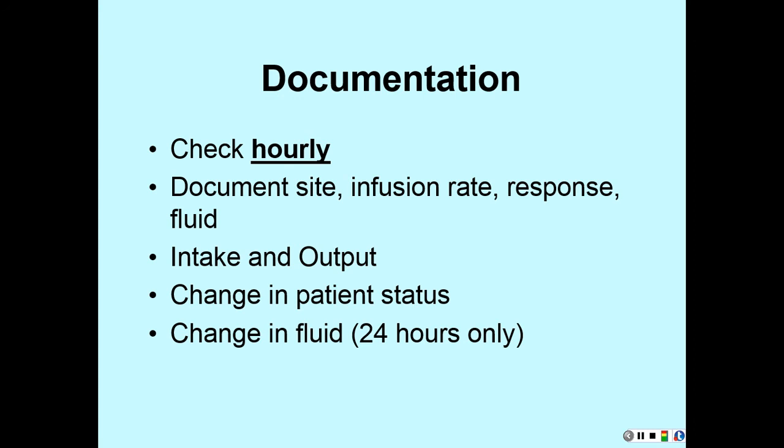You set it back down to 0. So when the next nurse goes in to get her IV counts, that's how much has infused since the last time you cleared it. So if I say cleared the pump, that means it cleared back down to 0 on the counter. Not the bag or anything like that, but it's done on the pump.